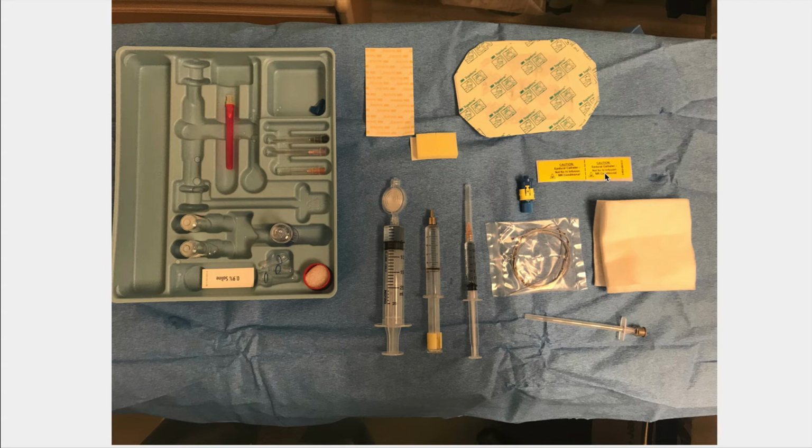This is a sticker that says caution that goes on this cap here. And this, of course, is your Tuohy needle, which is the needle that you use to introduce the catheter into the patient's back. Lastly, this is a sticker here that we'll go over in just a moment to help secure the epidural catheter in place.